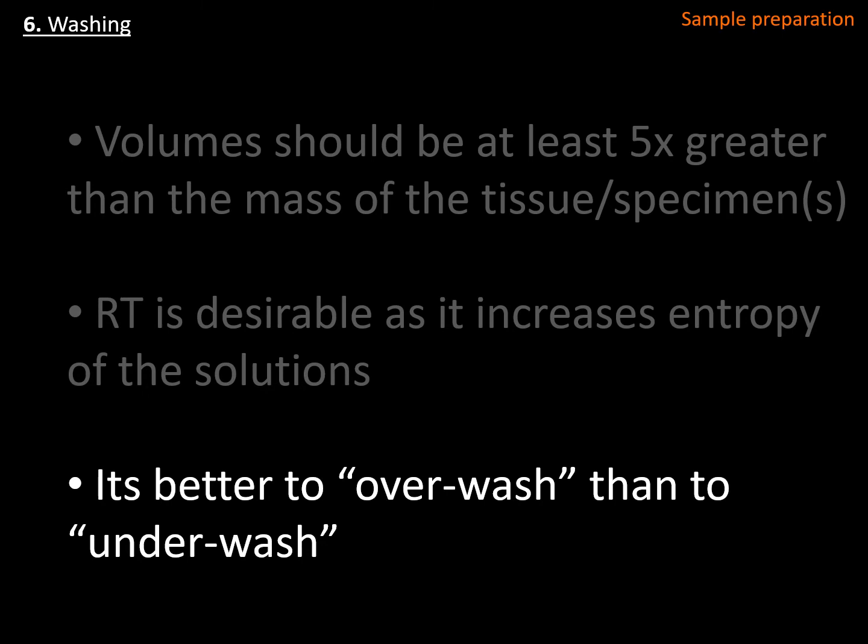And I always tend to overwash rather than underwash. What do I mean with that? I prefer to wash several longer times and more often. Although it takes me more time to run the procedures, in my experience this has revealed that you have less background and you have more pristine signal in the end of your experiments.